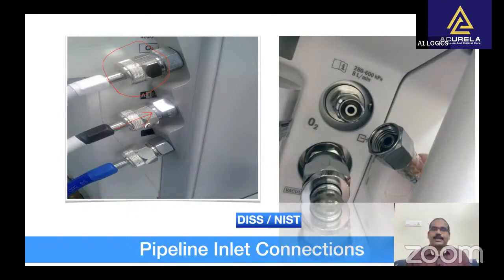Each inlet must contain a unidirectional or check valve to prevent reverse flow of gas from the machine into the pipeline system or to the atmosphere if no hose is connected. Each pipeline inlet is required to have a filter with a pore size of 100 micrometers or less.